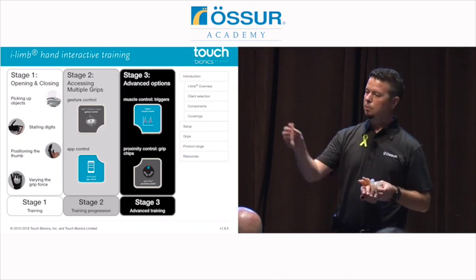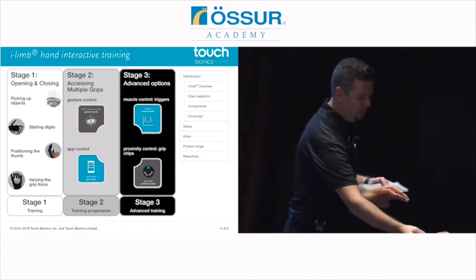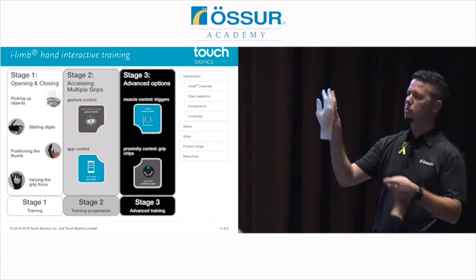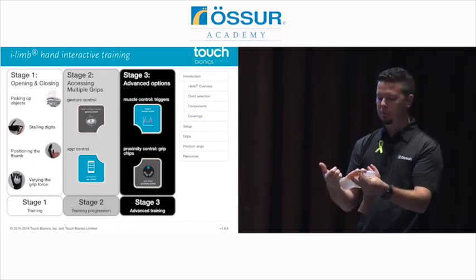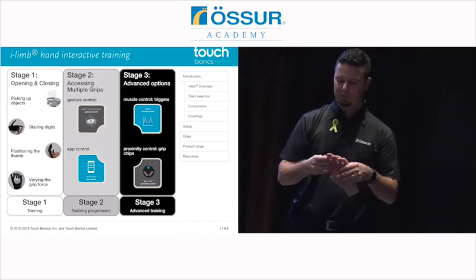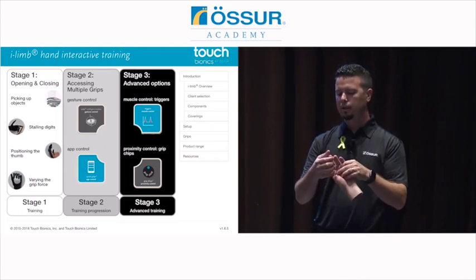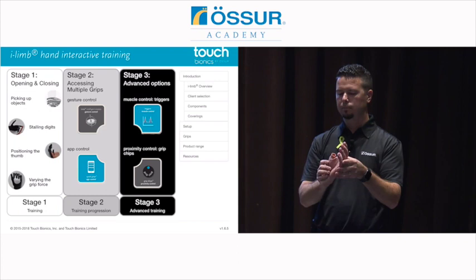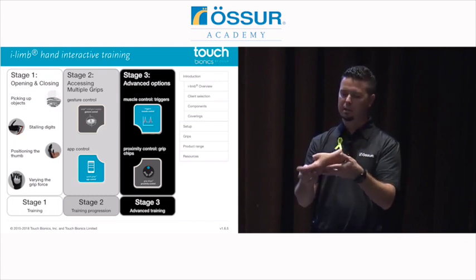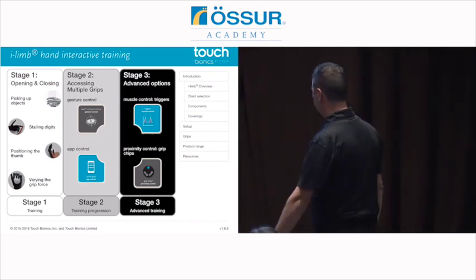Everything from a finger with a vinyl nail that can be painted. The paint is actually applied on the inside of the silicone, so it can't be worn off. And this is an example of one that started off as that hollow shell, and they've begun painting on this side, so you can kind of see that. And then this one is a finished device, has some armatures in it, some rigidity to help you pre-flex or pre-bend those fingers ever so slightly. And this individual has their thumb but was missing these four fingers, so there's an opening for the thumb to slide through to give you an idea of what that product looks like. They do amazing work.